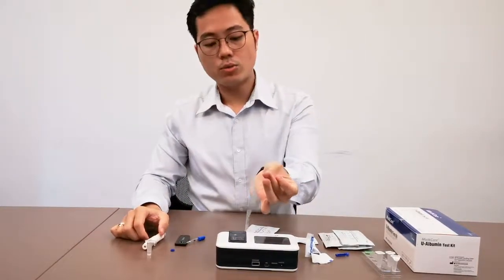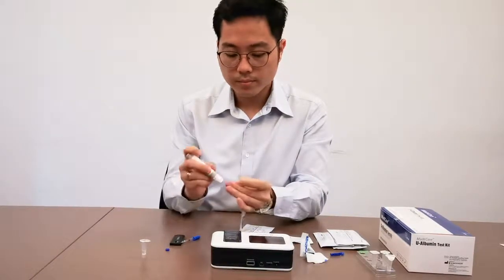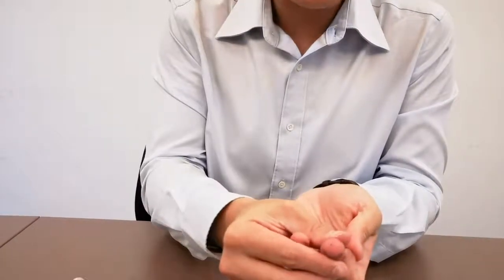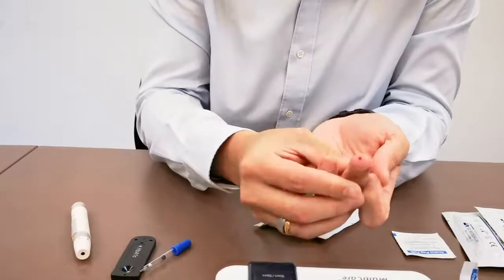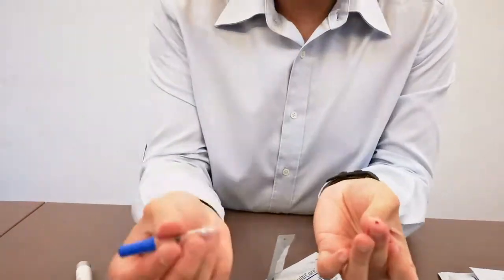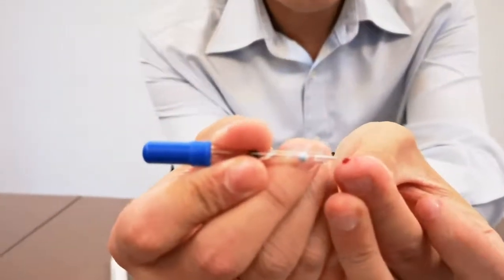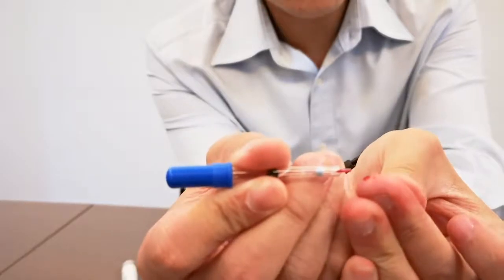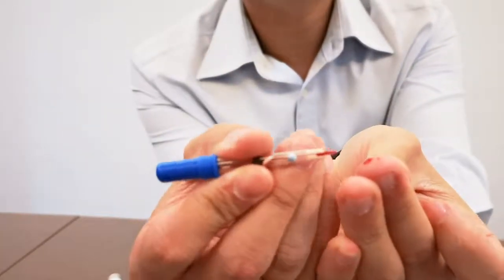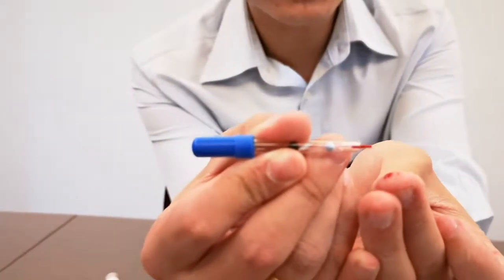So we proceed to prick the finger of the patient. We don't want to be squeezing it, so we have to push the blood this way. You'll see the blood forming. So what you do now is that you take this pipette and just touch — it will suck the blood through capillary action. And this is all the blood that you need. Once it's full, it doesn't suck the blood anymore, so your job is done.